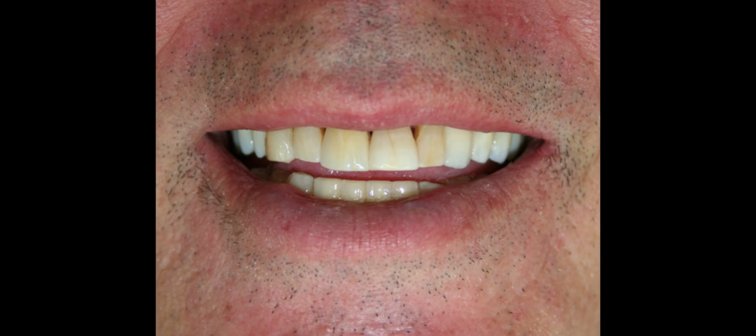Okay, so 7 years after the upper implants, the front implant and the back implants were placed, and about 18 years after the lower implants were placed, so 18 years, that was June of this year, June 2026, and you can see this is his smile, and we've maintained 4 of his natural teeth quite nicely, and we've restored the others and his function using implants and the crowns and bridges.